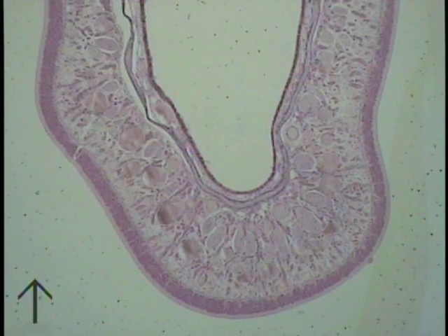Laboratory for the respiratory system. Learning objectives for the respiratory system. Be able to distinguish the various regions and subdivisions of the respiratory system and relate the morphological structures of each subdivision to its function. Begin with the conducting portion of the respiratory tree. This part of the tract consists of the nasal cavities, pharynx, larynx, trachea, and various subdivisions of the bronchial tree.